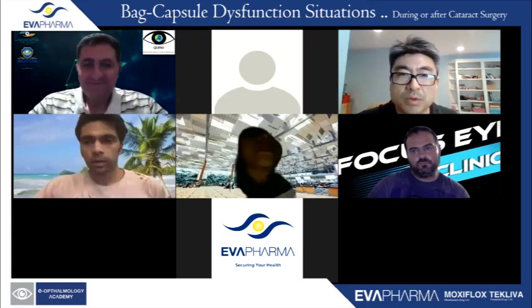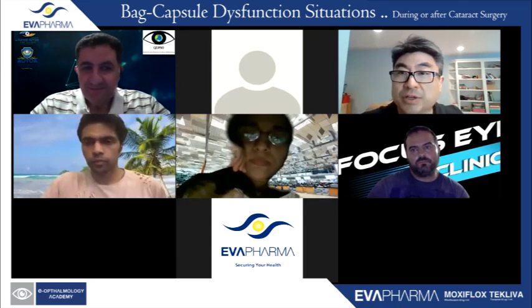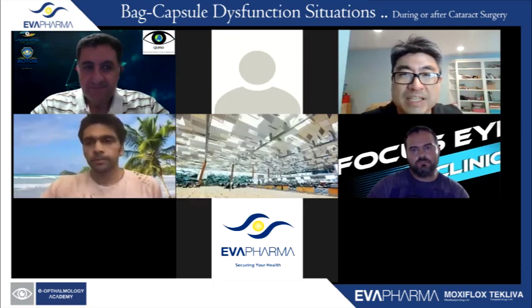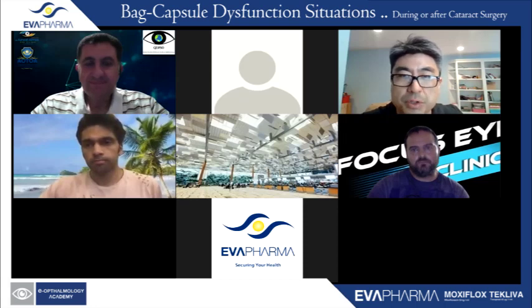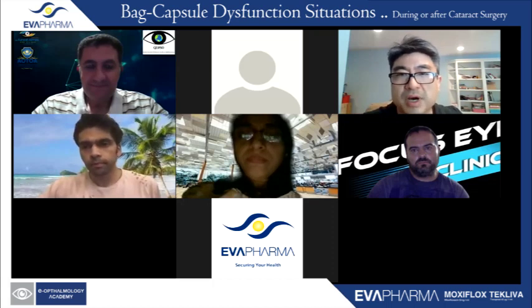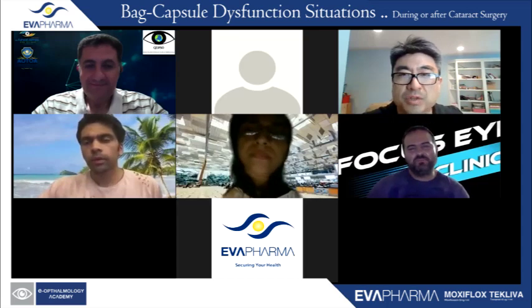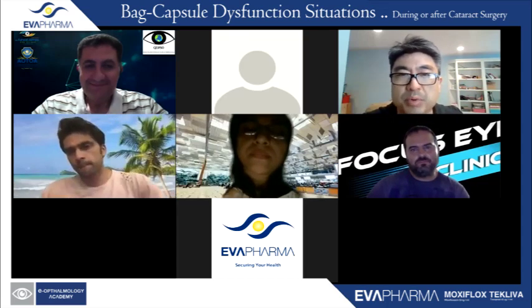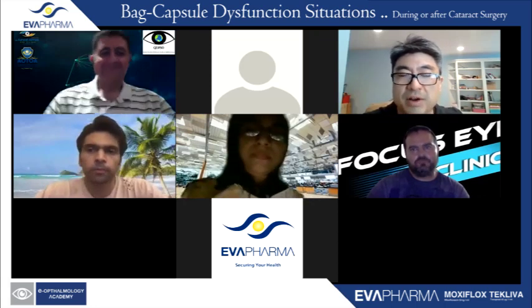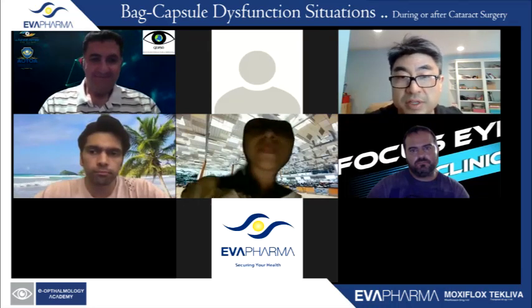Thank you. To Lukan's point, if the lens has been in there for God knows how long, I agree 100%. You're going to have less lens haptic manipulation with glued versus Yamani. You have to beat up the lens so much with Yamani. You're doing a lot of gymnastics potentially with it. And so if you have an old lens, it's going to break the haptic optic junction area. Whereas with glued, you wouldn't have that issue. If you're at all worried that you're going to manipulate the lens that much, I think the key would be to just take it out and then put another one in.